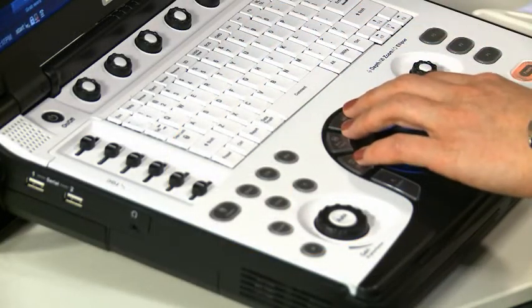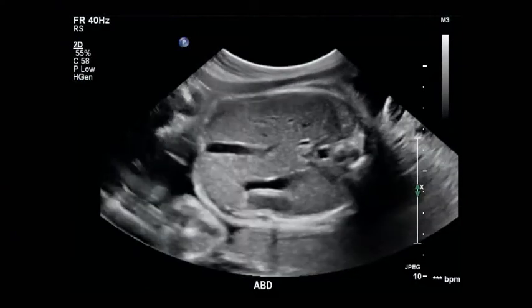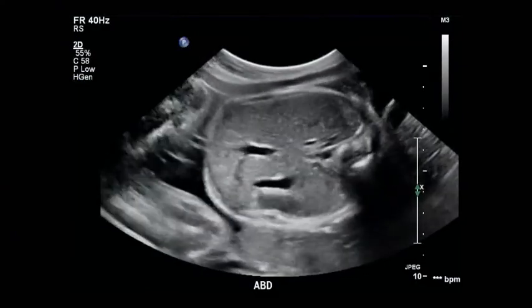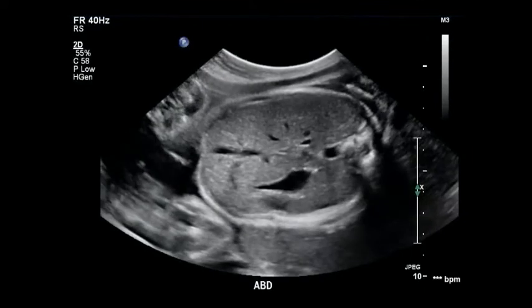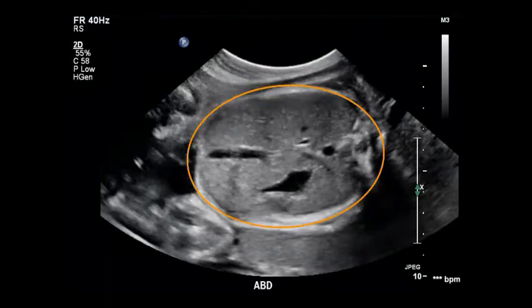Next, move on to measure the fetal abdomen. Important landmarks that you should see when measuring the AC are the umbilical vein and the stomach. You can see that the circumference is placed on the outside of the skin. Once you have the best possible measurement of the abdomen, store the image.